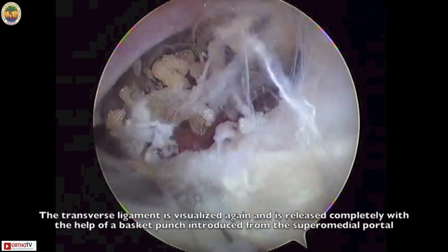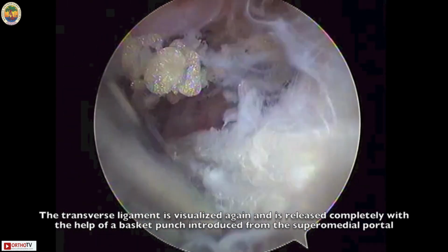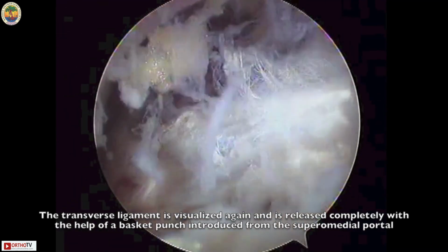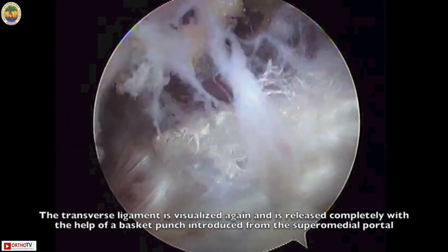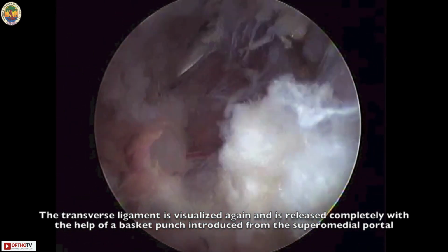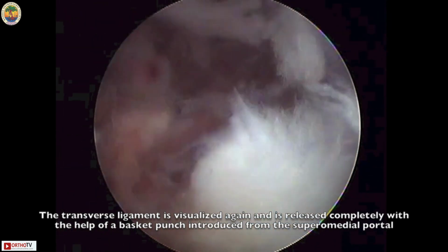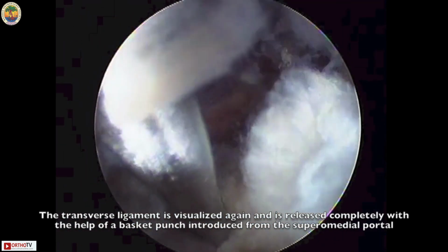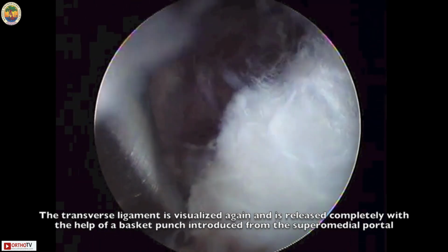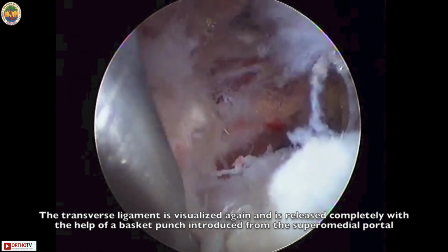This ligament is then transected with the help of basket punch inserted from the superior-medial portal. Below the ligament, the nerve is visualized crossing the notch. So this is how suprascapular nerve is decompressed.